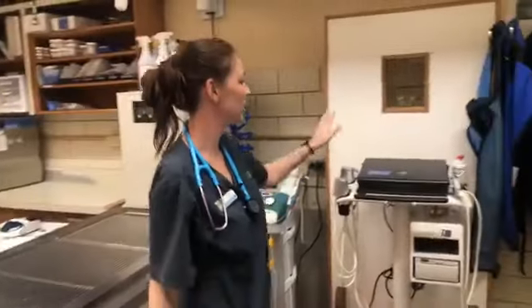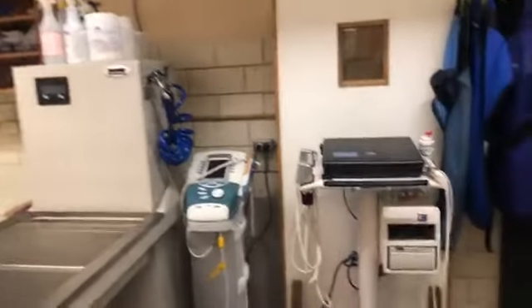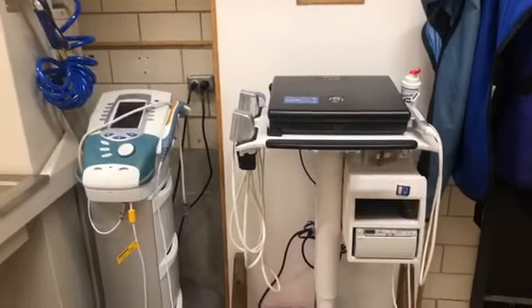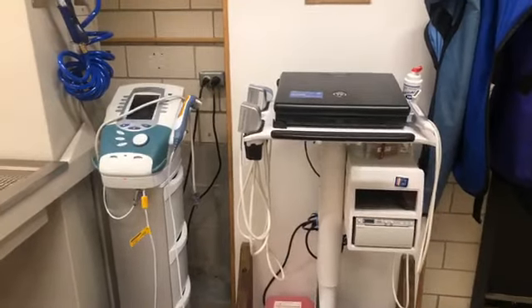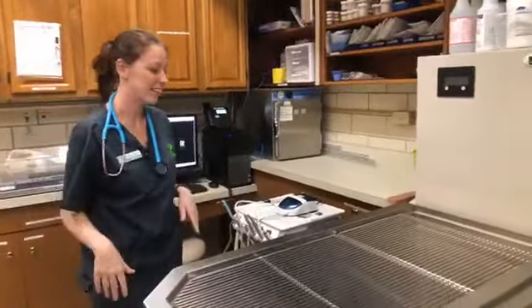We also have an ultrasound unit, so we can do abdominal ultrasound, echocardiogram, check what's going on on the inside, stuff that might not pick up on x-ray. And then I'm just going to take you around the room and just show you everything.